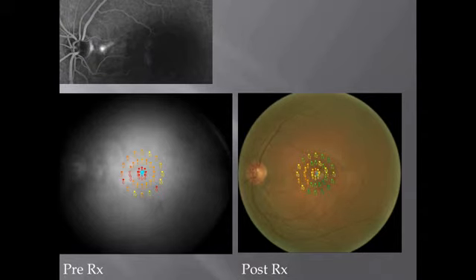So I think microperimetry helps you objectively document this aspect of the condition, where the patient is talking about his contrast, or he's talking about the color desaturation that he feels in spite of your having achieved the macula flattened.